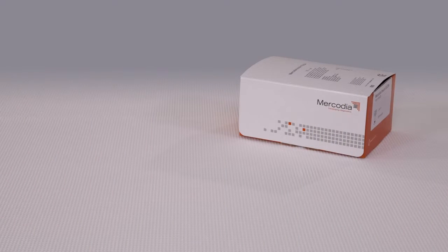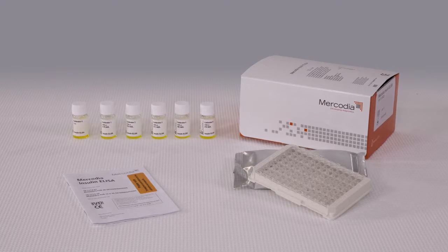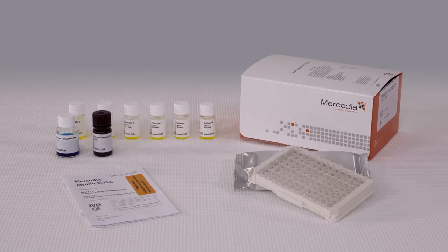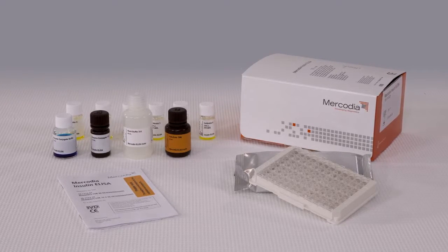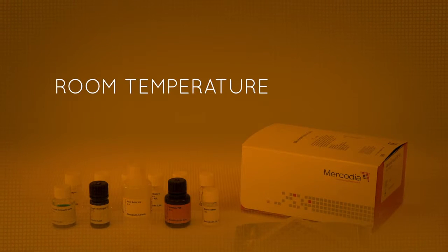In the ELISA box, you will find a 96 well-coated plate, calibrators, enzyme conjugate buffer, enzyme conjugate 11X, wash buffer 21X, substrate TMB, and stop solution. All reagents and samples must be brought to room temperature before use.